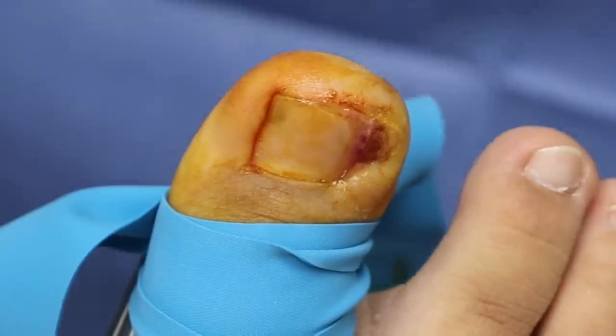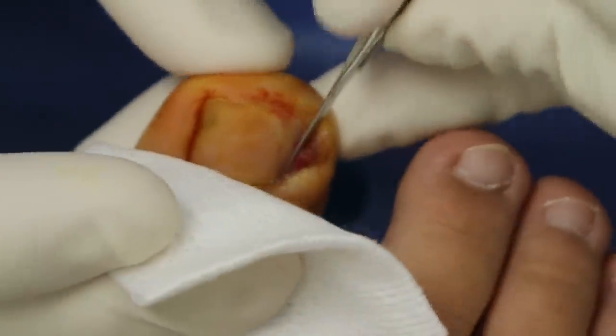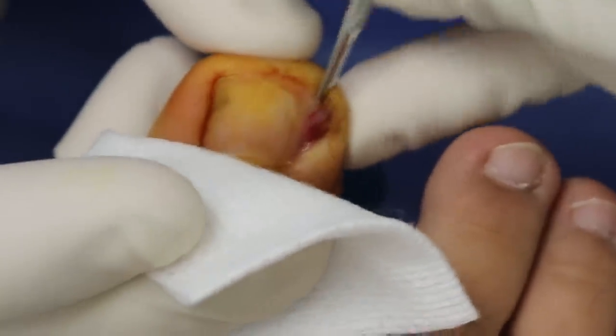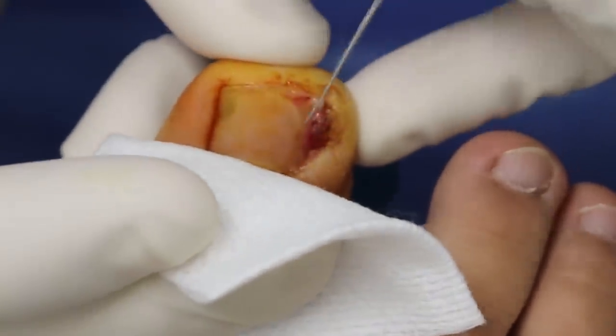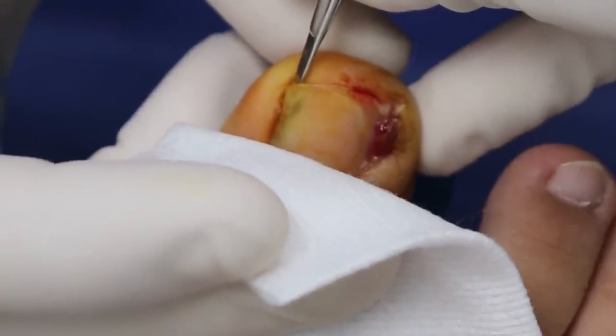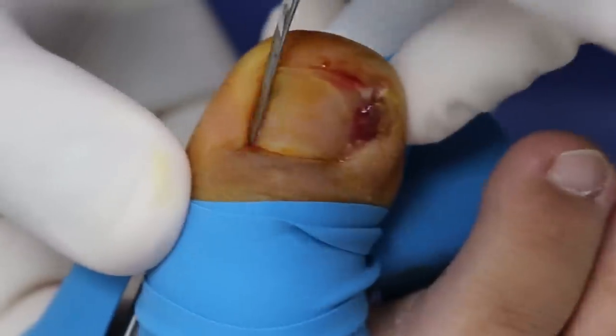So we're going to do our second little check, so I'm going to cover it. You relax. Anything sharp here? No. How about down here? No. And over here? No. Down here? Awesome. You did it. You got past the scary part.